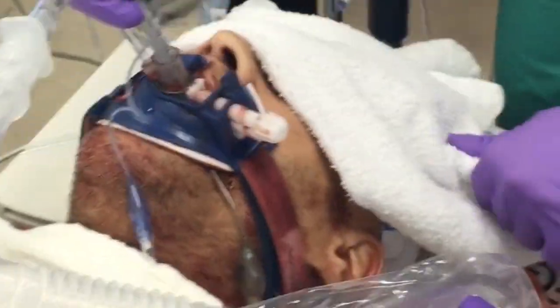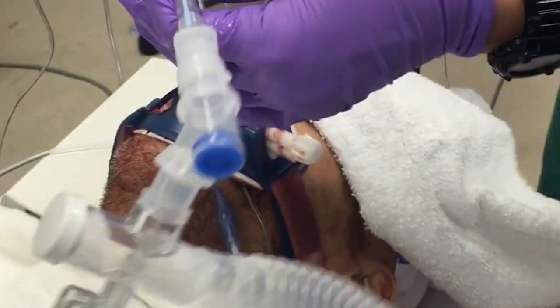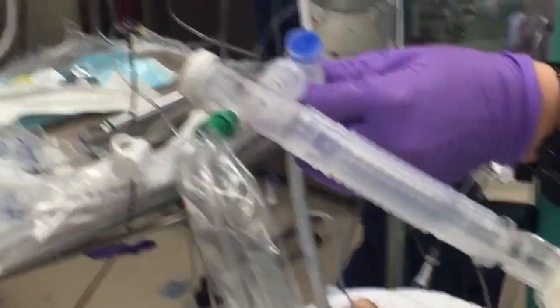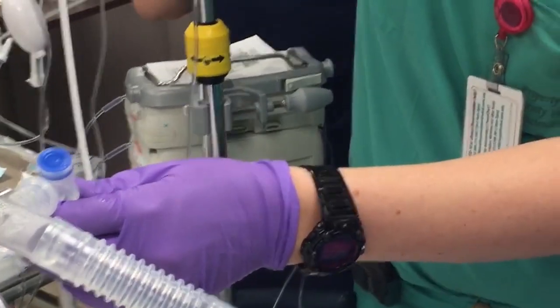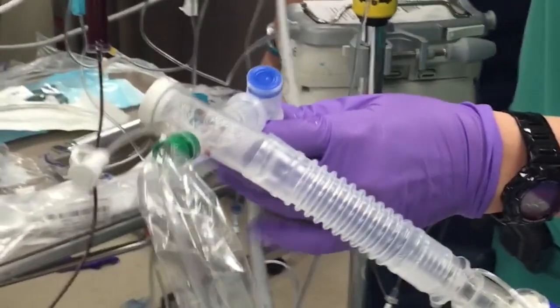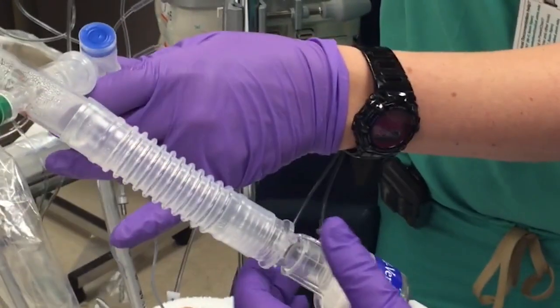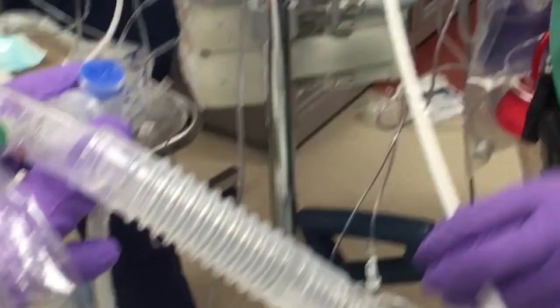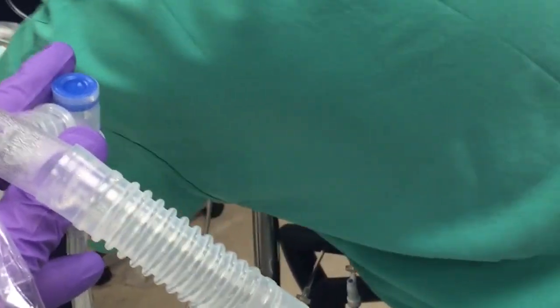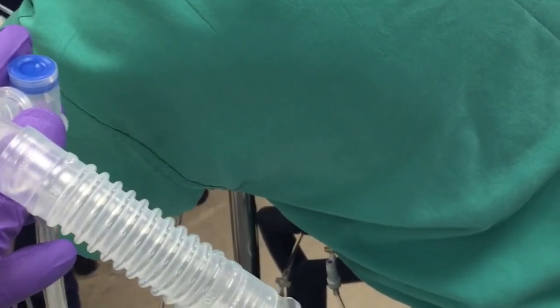Now take your A-scope and pass it through your bronc port. Keep track of your directional bend — you have to think about which way you're going to want to go when you come off the end. Pass it through your port and then lube the scope on the side. Don't get lube on the end — it's going to affect your view.